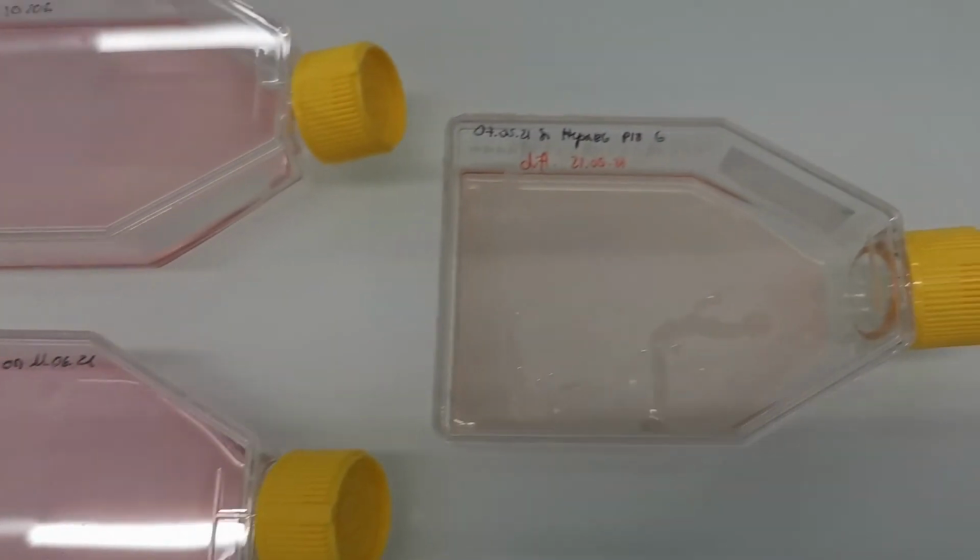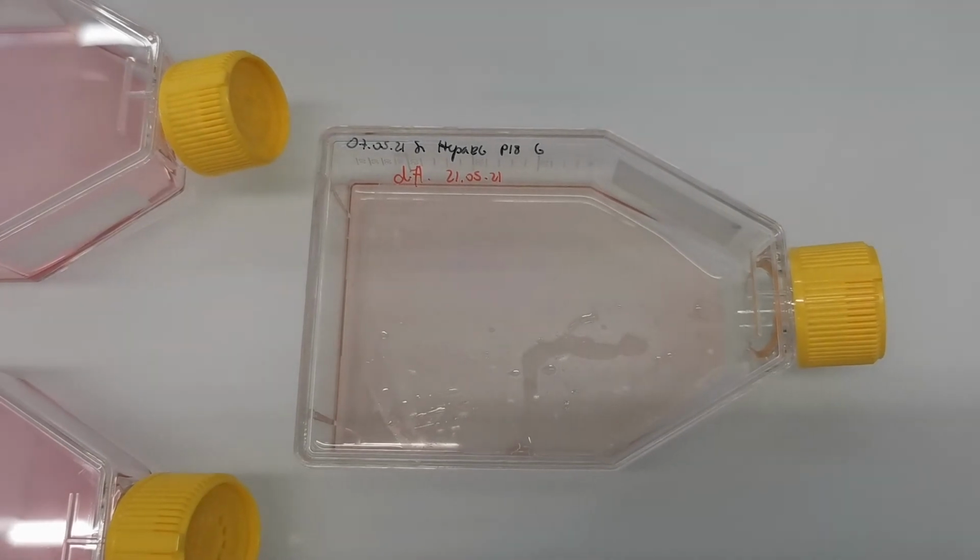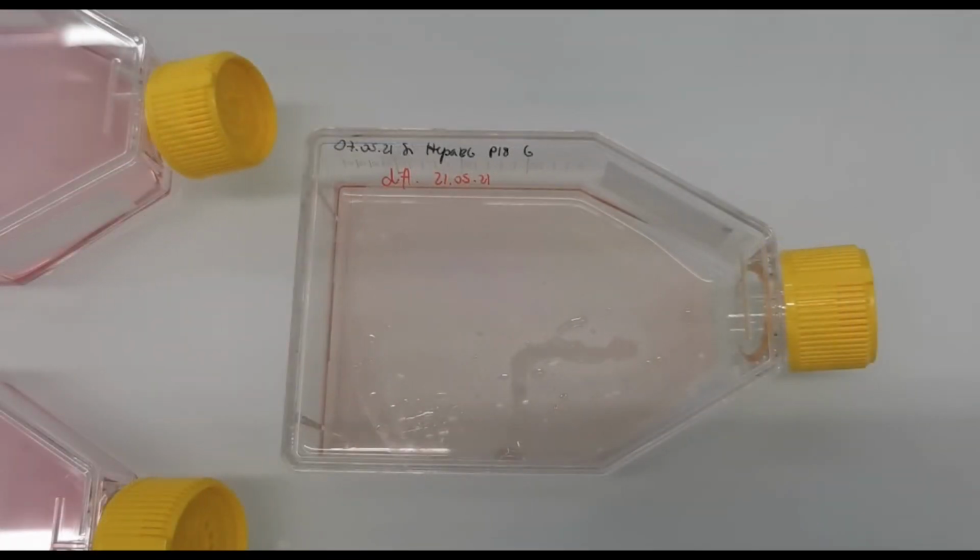Finally, we use the human cell line HepaRG from Biopredict International, and these HepaRG are differentiated in a specific differentiation medium for 2 weeks prior to use, and they serve as a great surrogate for hepatocytes.